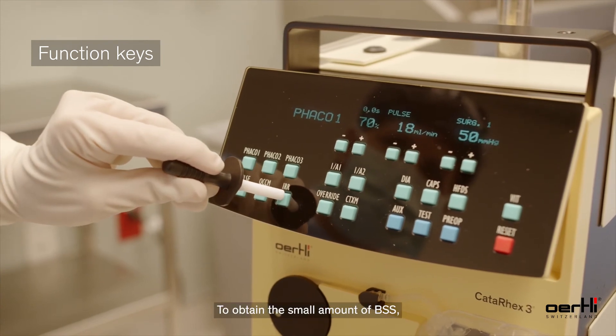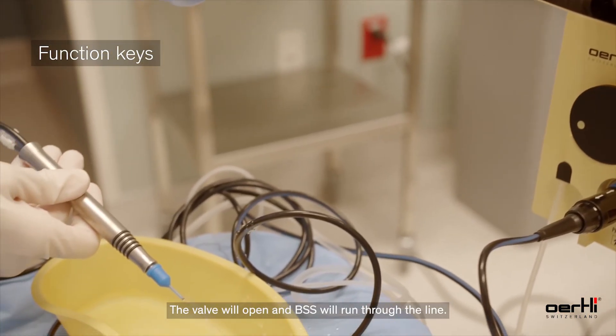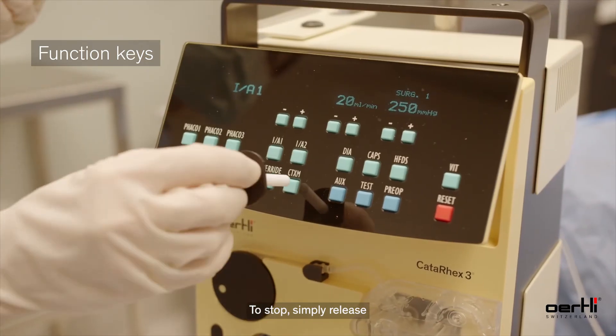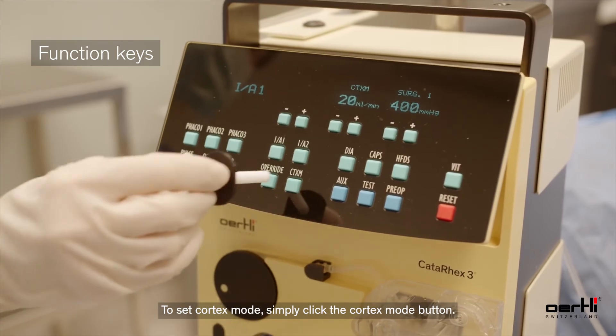To obtain a small amount of BSS, depress the IRR key on the display. The valve will open and BSS will run through the line. To stop, simply release. To set cortex mode, simply click the cortex mode button.